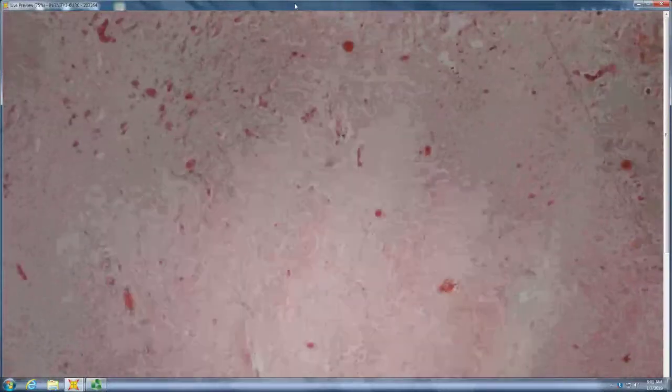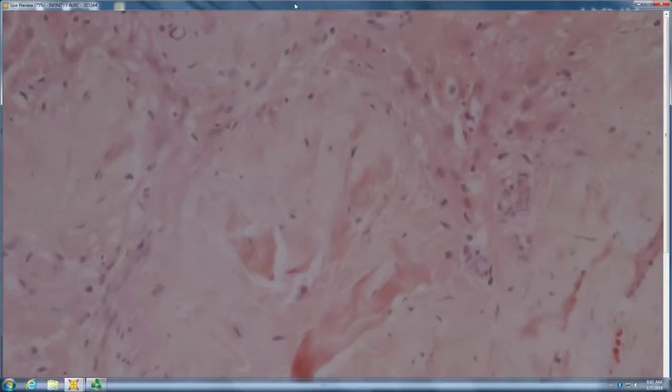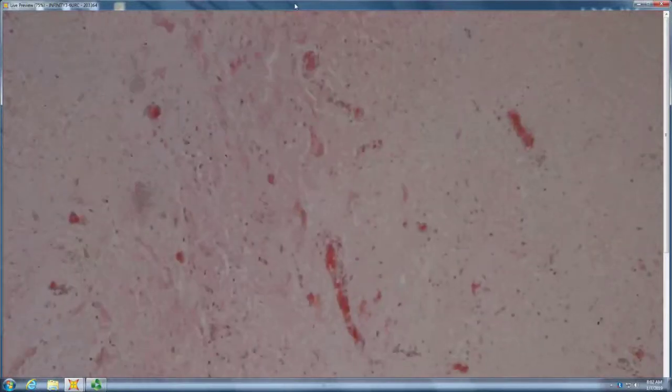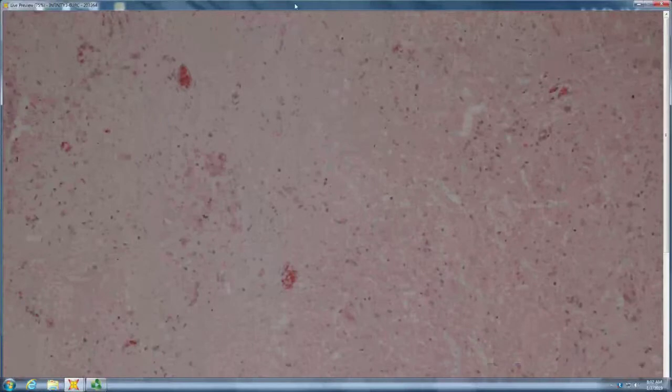And then this one, where you have skin, and then you're down in here, and you have these kind of similar but much larger cells. Looks like a glioma. Yeah, so glioma is a reasonable thought. This one's beyond glioma. This is brain. So this is true encephalocele that was cut into. Oops.